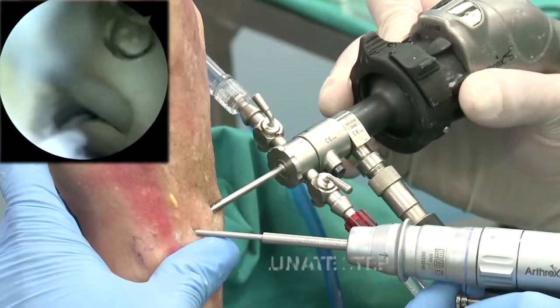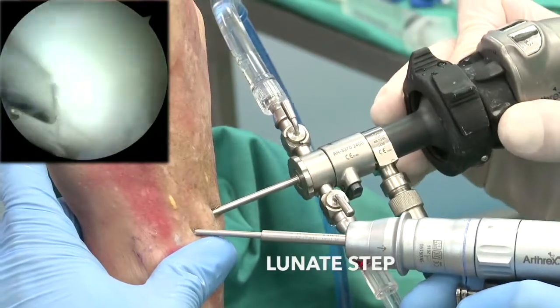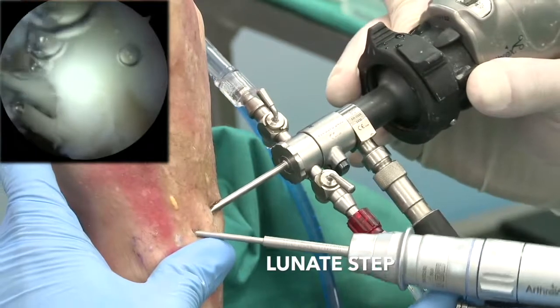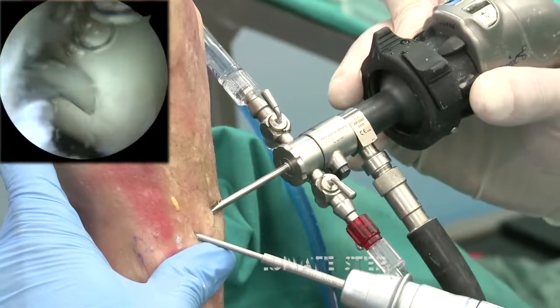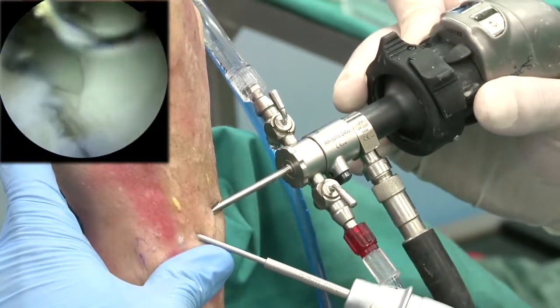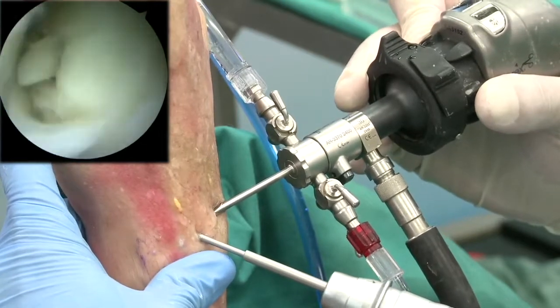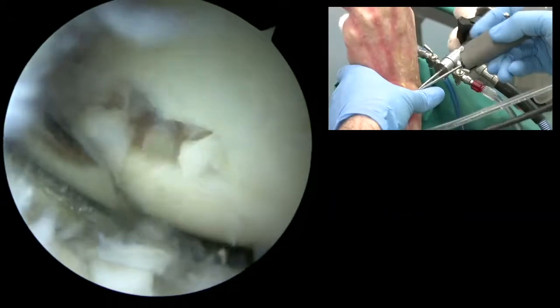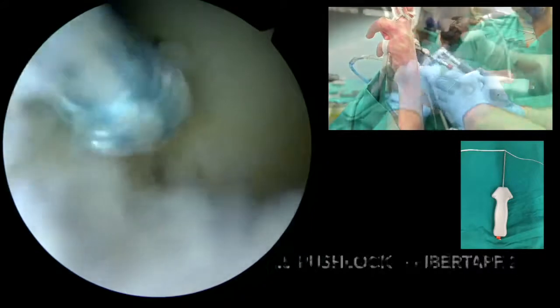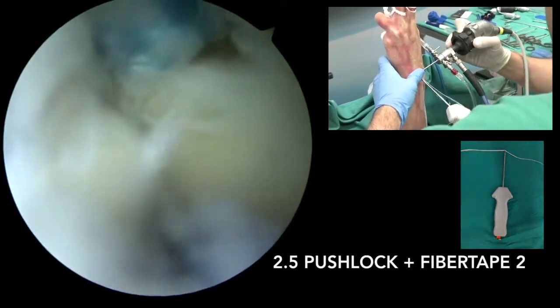With arthroscopic visualization through the 3-4 portal, we introduce a drill guide through the 4-5 portal and place it in the center of the lunate. An 8mm hole is created with a 2mm drill bit. Any soft tissue surrounding and inside the drill hole is then cleared.